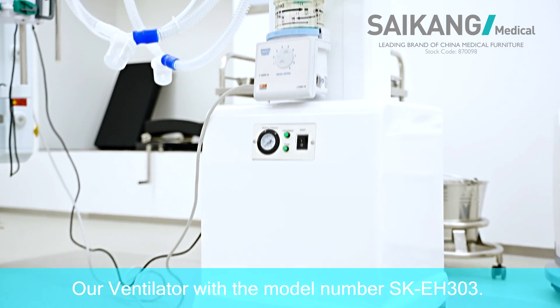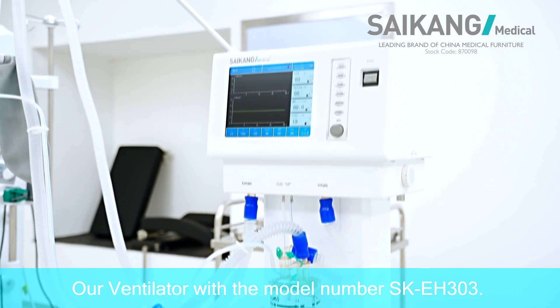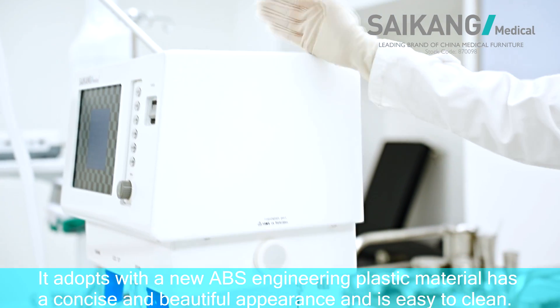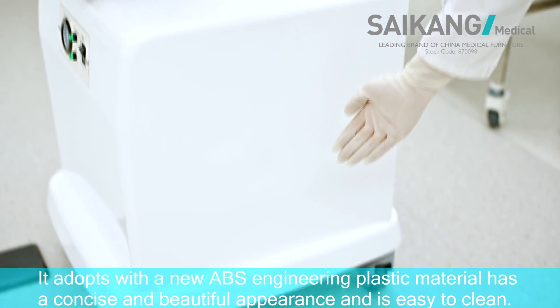Our ventilator with the model number SK-EH303 adopts a new ABS engineering plastic material, has a concise and beautiful appearance, and is easy to clean.